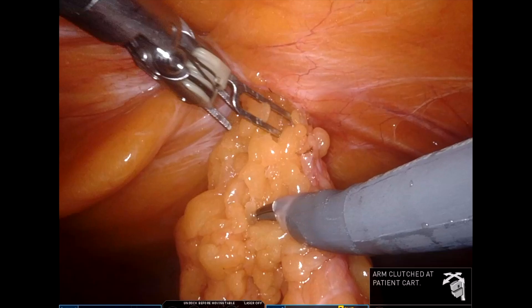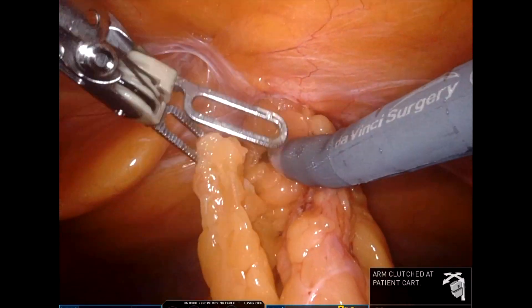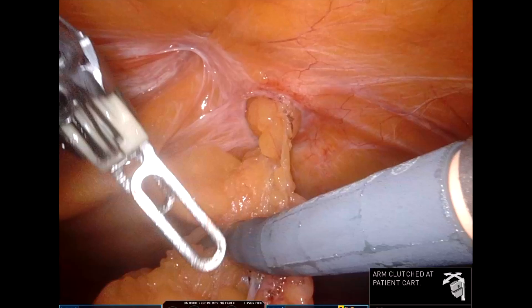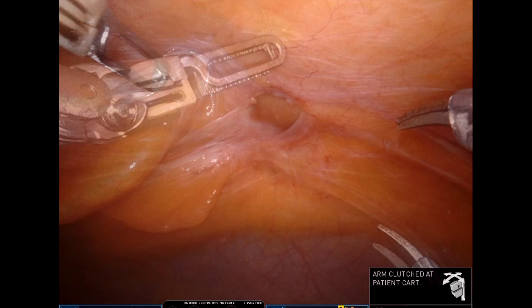After doing diagnostic laparoscopy, we reduce the hernial contents. This step can be performed laparoscopically as well, especially if the content is bowel. I have a fenestrated bipolar in my left hand and a scissor in my right hand.